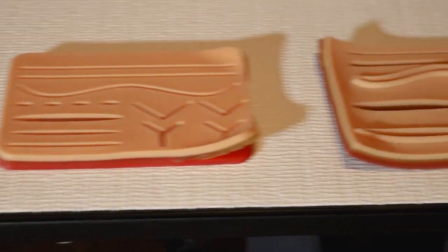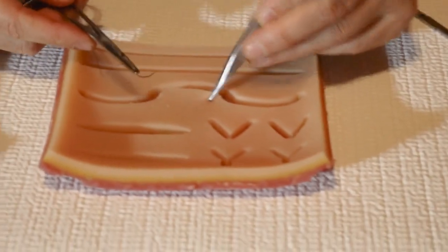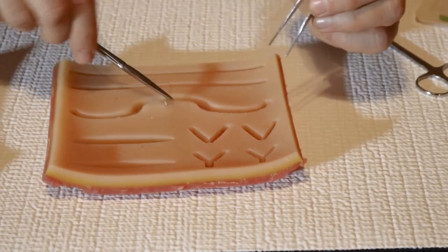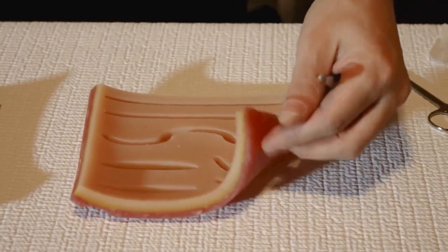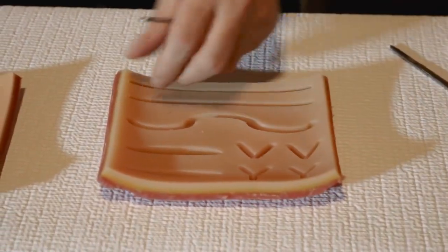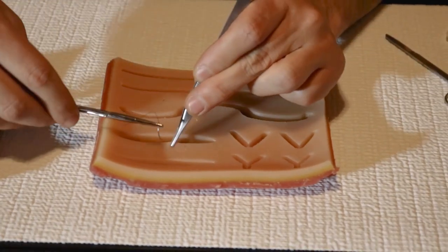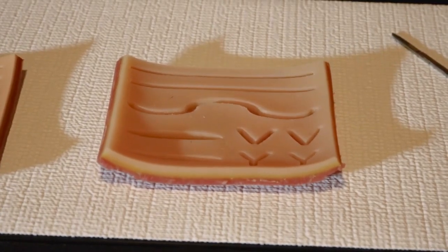Skipping over to this next one — someone did a better job making the lacerations deeper, so you definitely get a good bite out of this one. A couple of things I don't like: within the first week I had it, it started curling up pretty bad. Secondly, it doesn't have a mesh layer like the SutureBuddy suture pad. If you want to go cheap, this is one option.